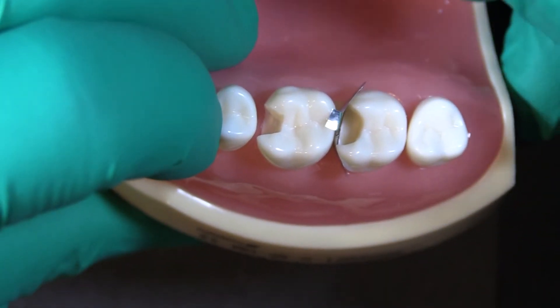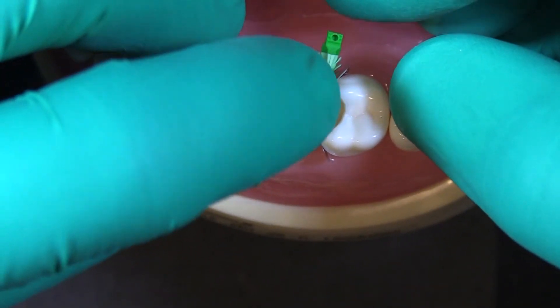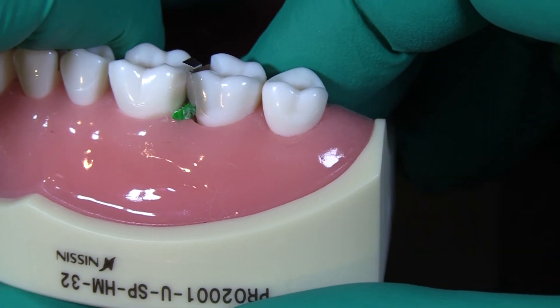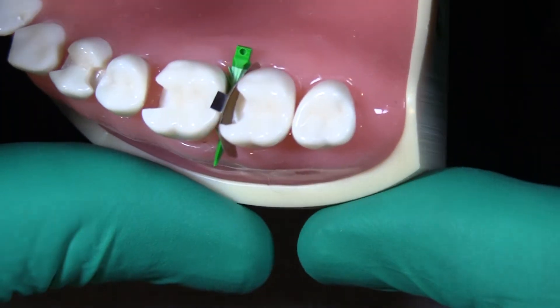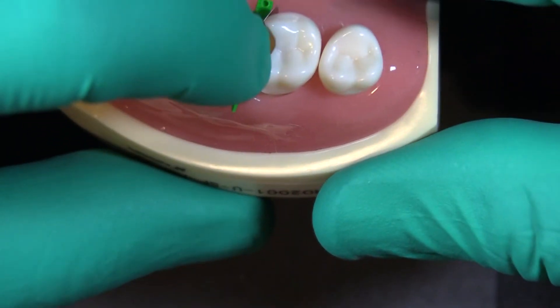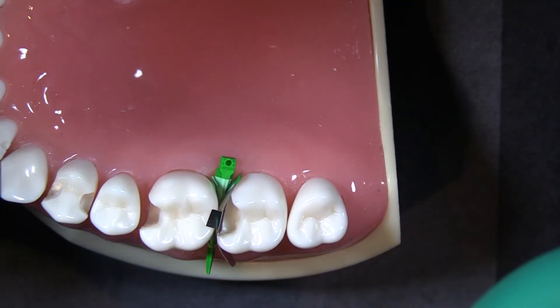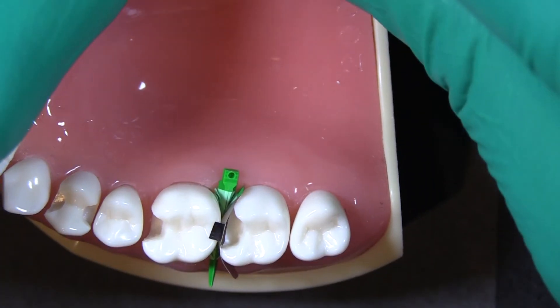Once that's completed, I have room to get my wedge in there. I want to engage those little fins — engage the side of the tooth — making sure that wedge goes into the right area. Now you can see we have our wedge pushing our matrix band up against the tooth. Even though this kit is for deep margin elevation, you can definitely use it for that, but you can also use it in just deeper class 2s where you need to accomplish more challenging preparations. You can place your ring on at this point. I also go to the real matrix system if I have a more complicated outline of my gingival floor.